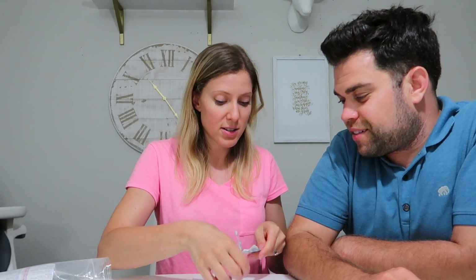There's a way that you put your finger on your hip and then your thumb goes on your butt, and it's the muscle right in the middle. Mm-hmm. Well, my doctor's office drew on me in Sharpie. And it's awesome. So she has bullseyes on her butt. I have bullseyes on my tushy, guys. So. Oh, did I say butt? I meant tushy. Here's some alcohol to keep this clean.